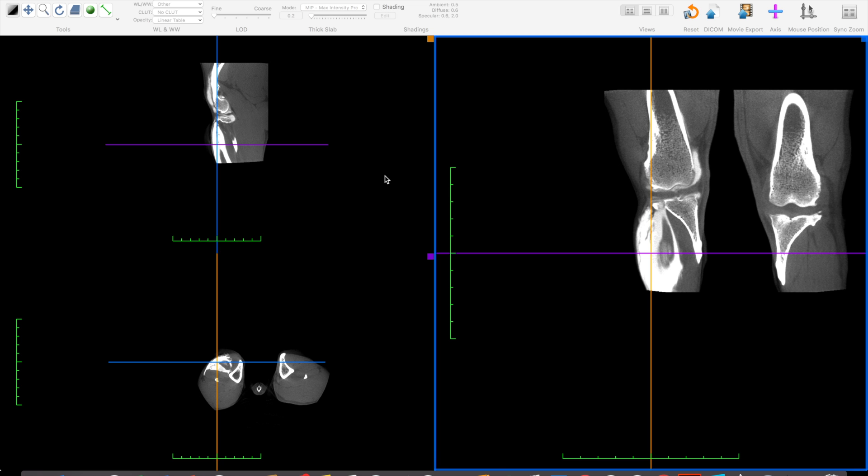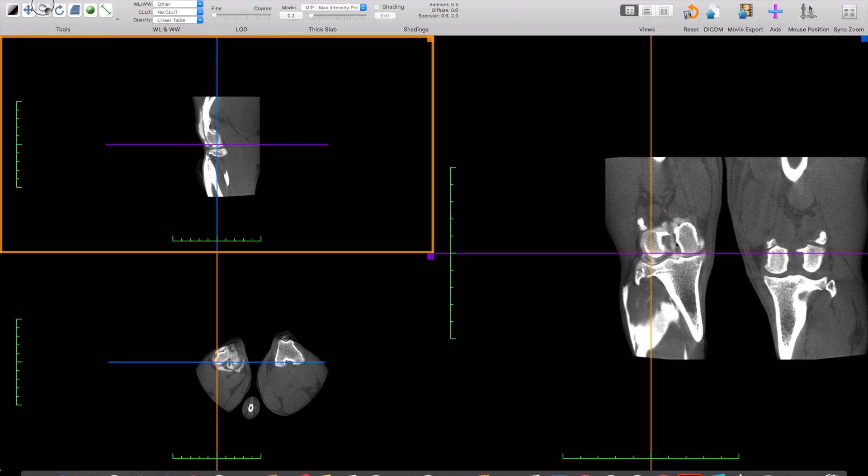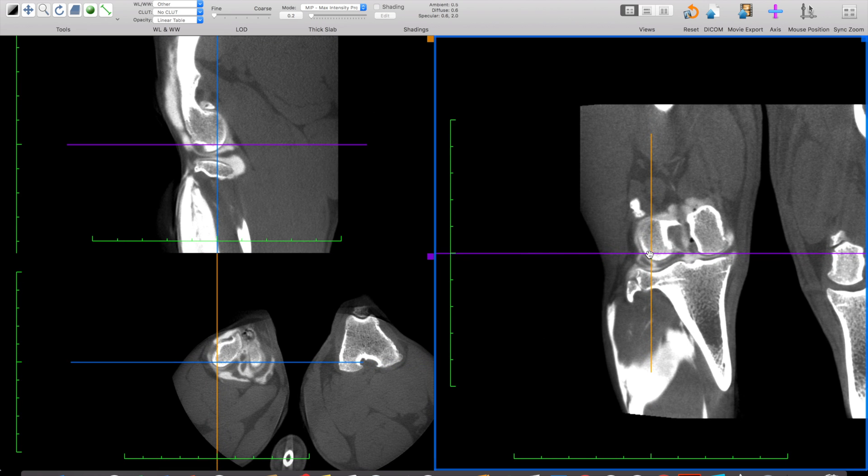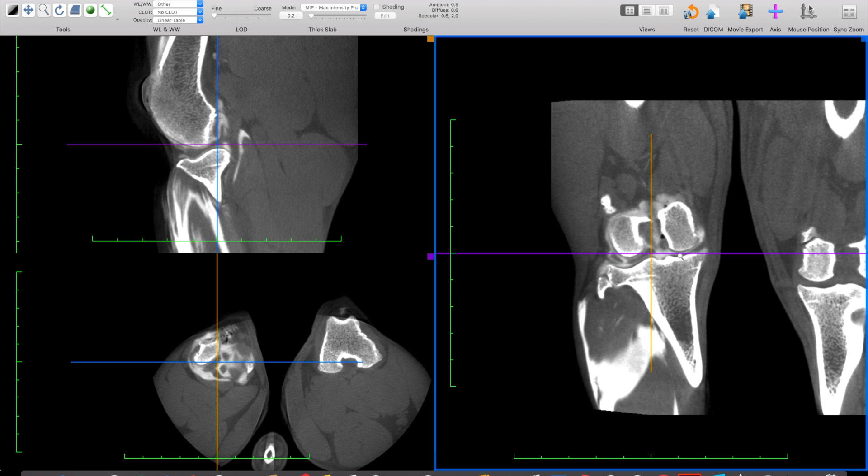I've opened my Horos DICOM Viewer on my MacBook and I'm going to show you some cases. This first case is a patient that is about 40 pounds, mixed breed canine. This blob that we're seeing in the far right image in the caudal aspect of the stifle joint — this blob of white is contrast material. This is what happens when we deliver too much contrast into the joint space. The good news is in this particular animal, even though we over-delivered contrast, we still get some detail in the joint space that gives us information about what's going on.